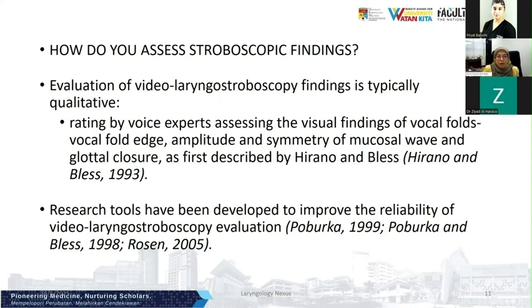People have developed many tools on how to evaluate and document stroboscopic findings. This is important so that you can standardize the way you document and the way you communicate with each other. So there are many tools available.